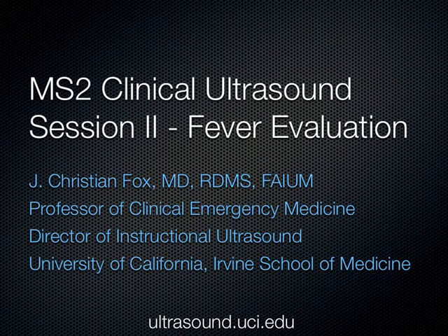This time we're going to be talking about fever evaluation, and we're trying to coordinate the curriculum in the ultrasound as close as we can with your other curriculum. Since right now you guys are focused on fevers and infections, I thought I would go through the approach to a patient who has a fever using ultrasound.